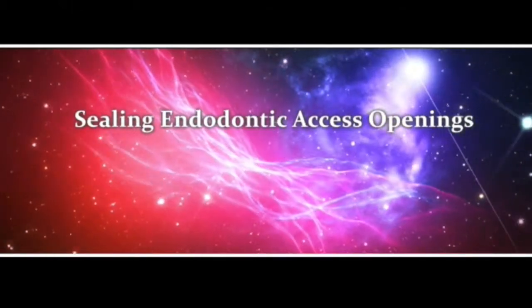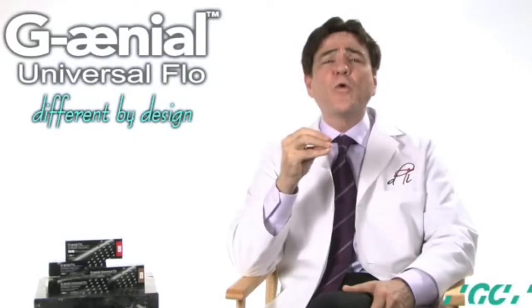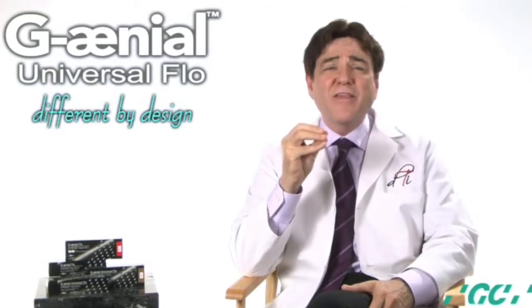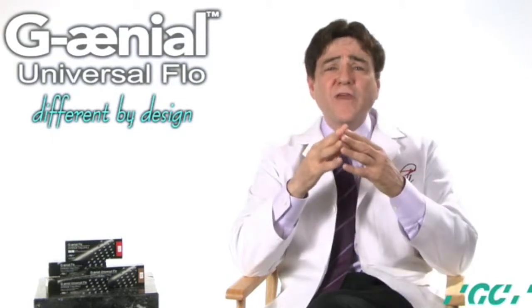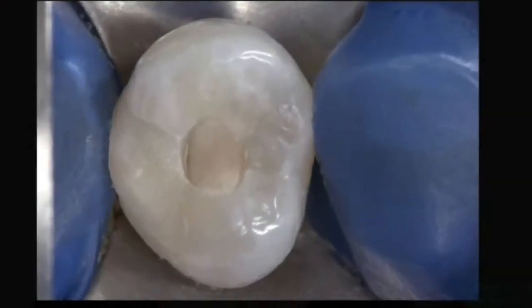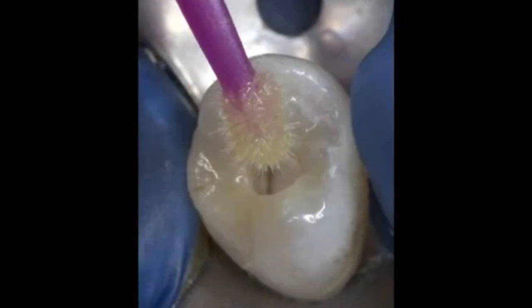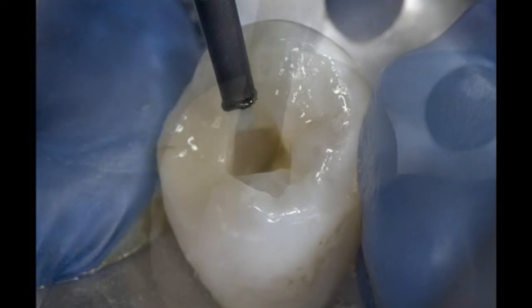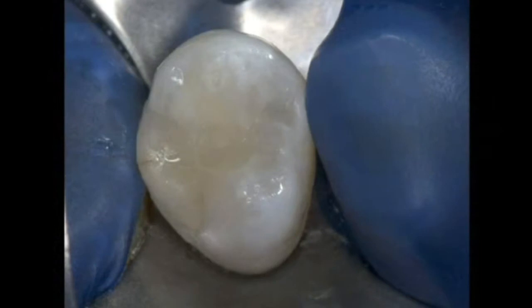Sealing endodontic access openings. An inadequate coronal seal after endodontic therapy can allow saliva to reach the apical region of the tooth in as little time as 3 days. One material and method that can be utilized for sealing the endodontic access opening is a simple technique that involves self-etch adhesives such as Genial Bond and a next-generation flowable. This bioadhesive procedure can restore or provide a transitional seal until a new restoration can be placed.